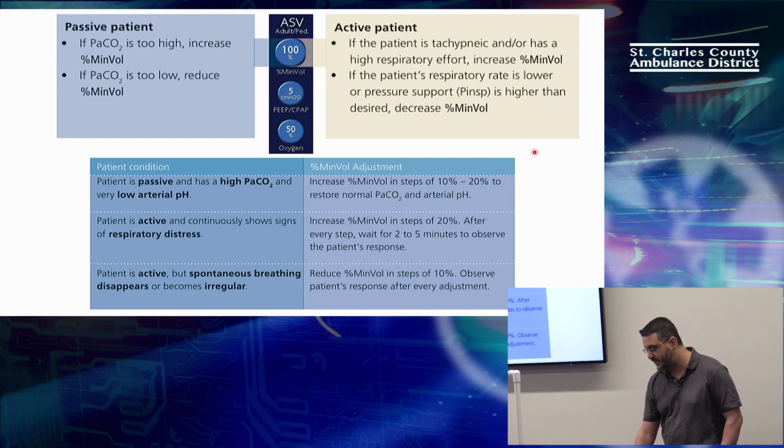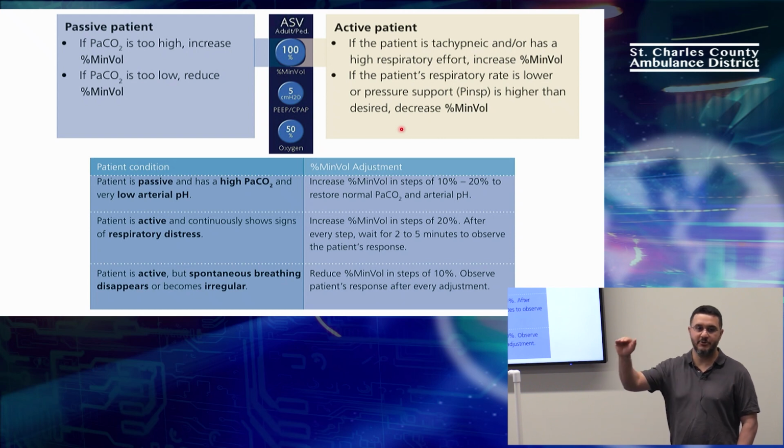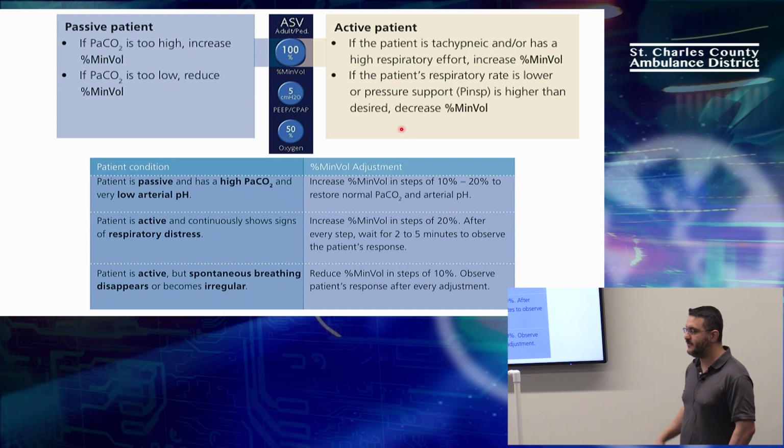That's what the manual is saying here. I brought up this slide. I literally screenshotted the manual, and it says go up by 10 to 20%. So I don't know what your guys' guidelines say. Sometimes 20%. I would probably favor 20% increments because your drive times are so short, and you just don't have enough time to sit there at 10%. In the hospital, they've got all the time in the world. They can drink coffee and go 10% at a time and stuff like that.